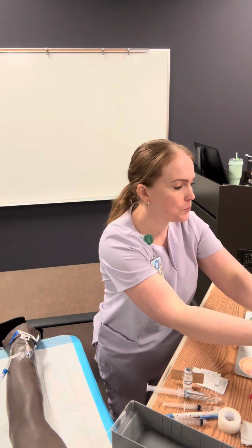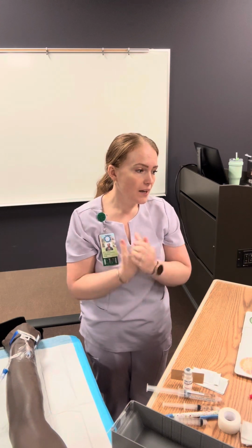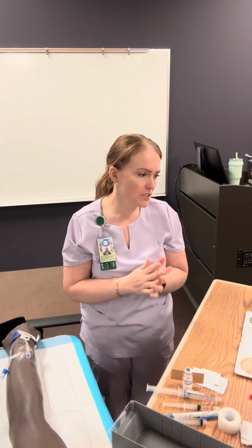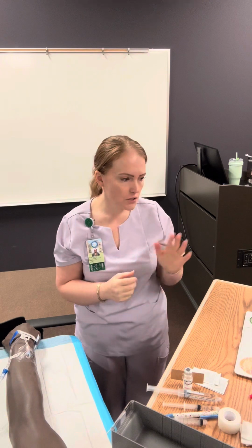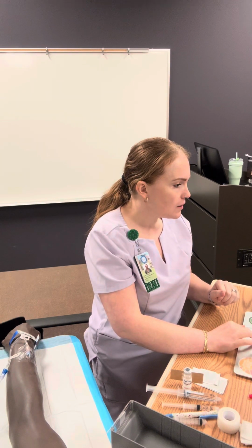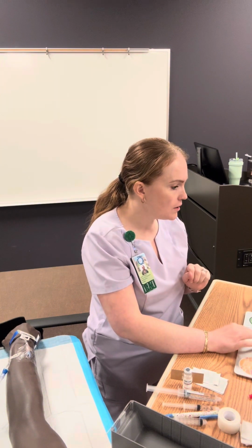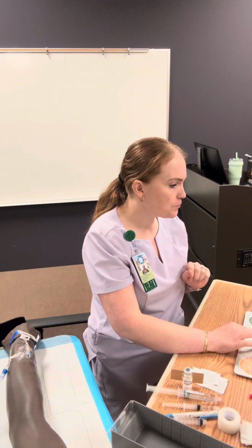I'm going to go ahead and give myself some hand hygiene here. And I am going to take off the medication and remove the IV altogether, which is very exciting. I'm going to verify that we have an order for that first. So I'm going to pull over into my computer here, going down to the orders, and ensuring that at the top it says Code Brown 6/18/51. I see discontinue IV for today's date at this time.